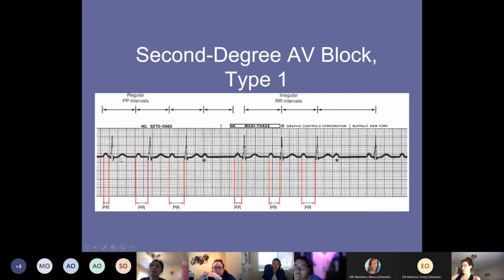So anyways, it's long, longer, drop. Now you have a Wenckebach. It's when the PR intervals become longer until a QRS drops off. Long, longer, drop. Now you have a Wenckebach. Spelling does not count on this test. So if all you can think of on a test is Wenckebach, then just spell it the best that you can. You can either call it a second degree AV block type 1, or you can call it Wenckebach, either or.